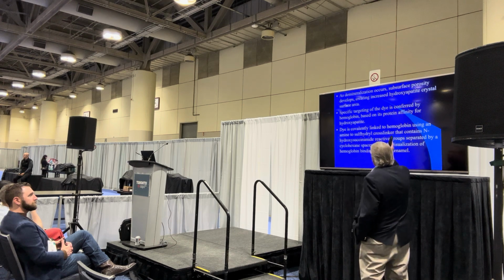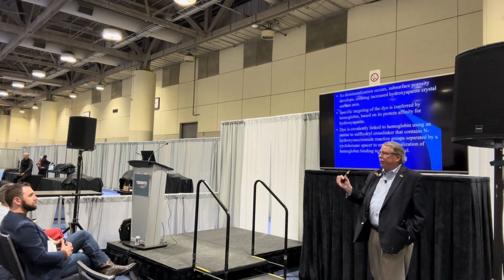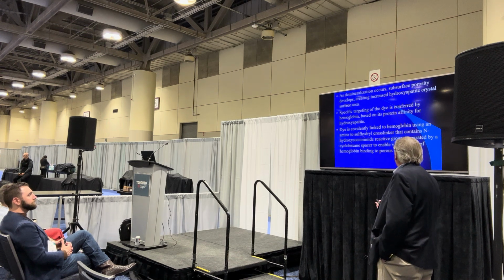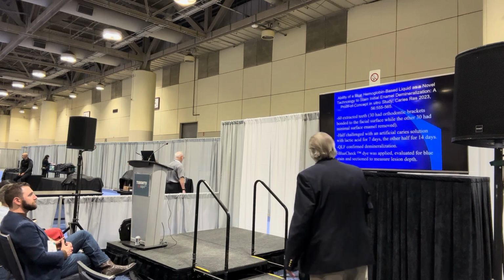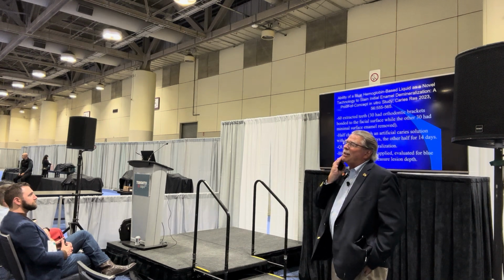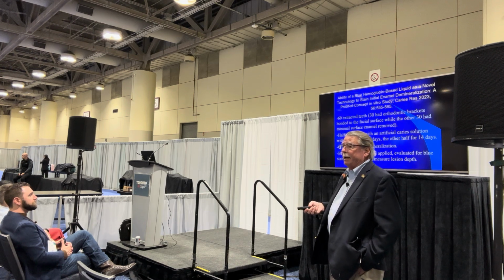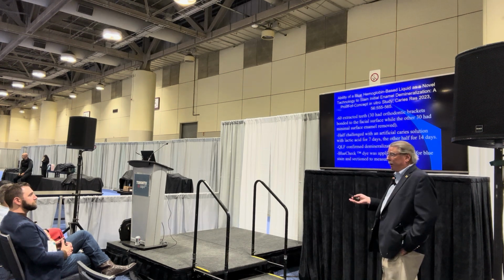So you can target this dye, and the protein, hemoglobin, carries the dye with a cross-linker. The dye is covalently linked, I told you, to hemoglobin. And that's what makes it visual, because of the dye, the blue color. So the first thing I do whenever I'm talking about it, I talked with the company and asked, what are the publications? By that time, I'd already done a lit review. There were pretty significant publications, not a lot, but significant enough. I thought it gave me a good feel for what's going on.